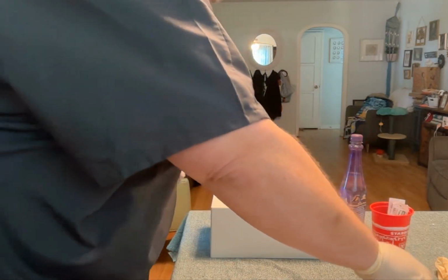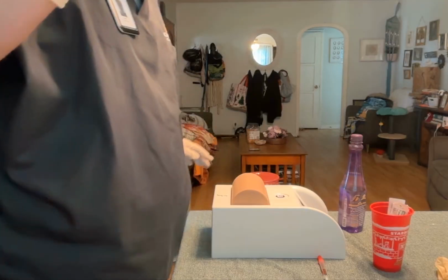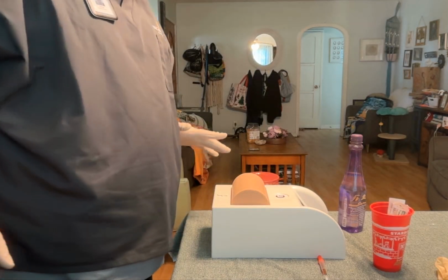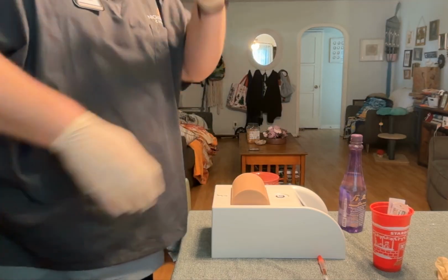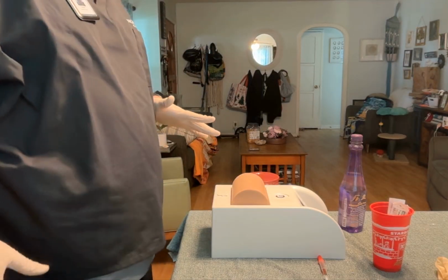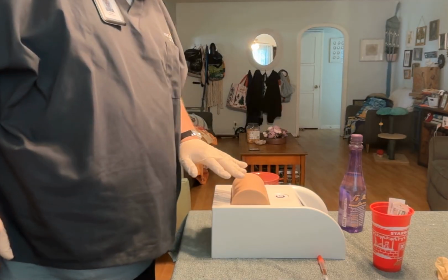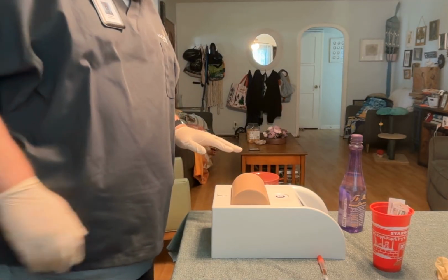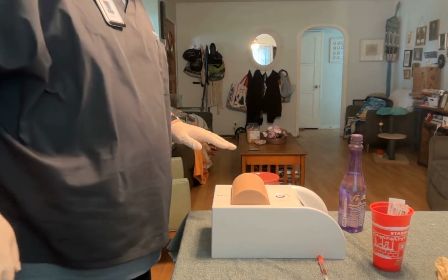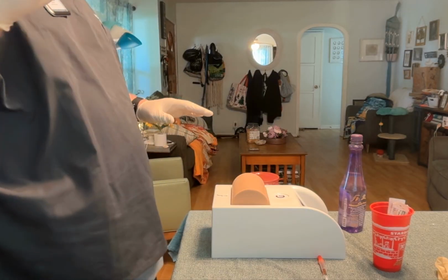I'm going to recap my needle with one hand. And now I'm going to inspect her site. We're going to do the lower abdomen. We could do the back of the arm, but since she's laying down, the lower abdomen is probably more important. I'm going to inspect the site, look for any bruising or any hard spots. I'm going to palpate, see if there's any tenderness or soreness in the spot that we've chosen. There is not.